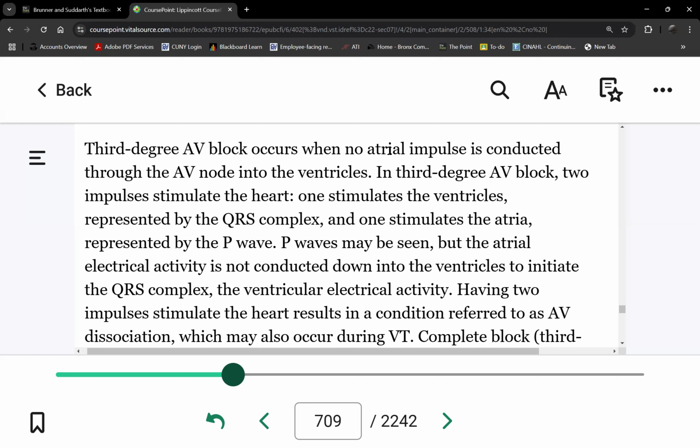Any questions? So for temporary pacemaker, you can either have transcutaneous, good only for how long? A few hours. Transvenous, a few weeks. And then of course we will have a permanent pacemaker, which can either be regular pacemakers with leads. Nowadays, we have leadless pacemakers. You've seen a pacemaker? It's a round device, right? Round or circular, or like a square with round edges.